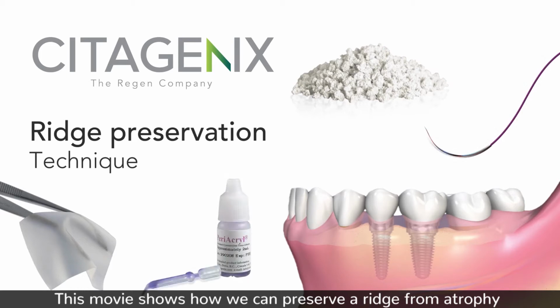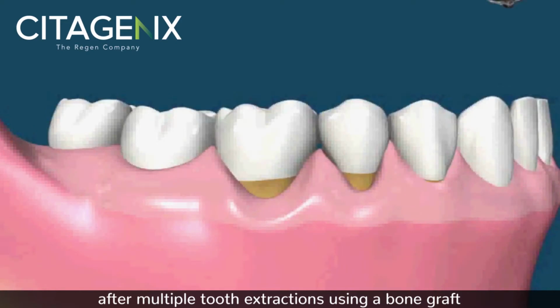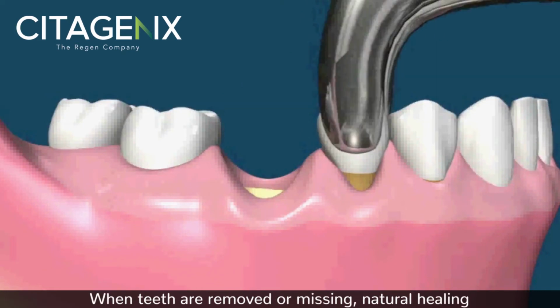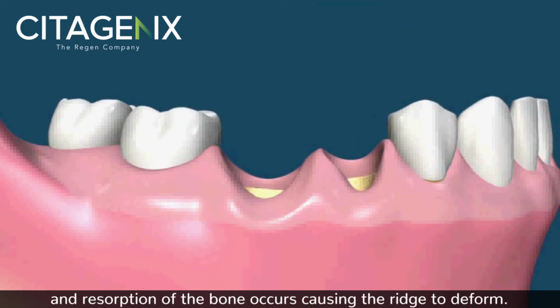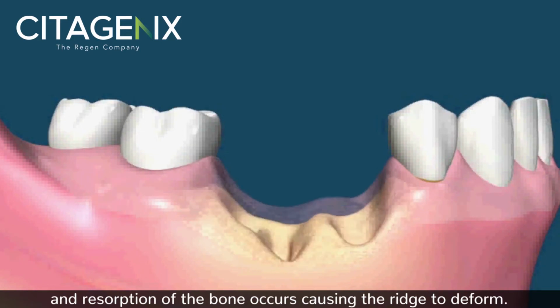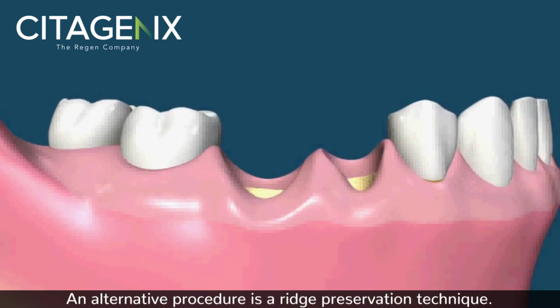This movie shows how we can preserve a ridge from atrophy after multiple tooth extractions using a bone graft and a resorbable collagen membrane. When teeth are removed or missing, natural healing and resorption of the bone occurs, causing the ridge to deform. An alternative procedure is a ridge preservation technique.